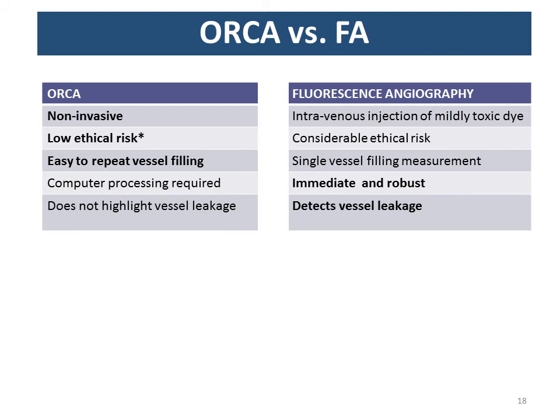Now, if you're looking at vessel filling, you could do repeat measurements of this very quickly. So you could do a different measurement every 2 minutes, say. But with fluorescence angiography, if for some reason the subject isn't ready when the vessels are filling, you're sort of stuffed because you can only do that about once a day. It takes a long time for that fluorescence to be removed from the circulation.